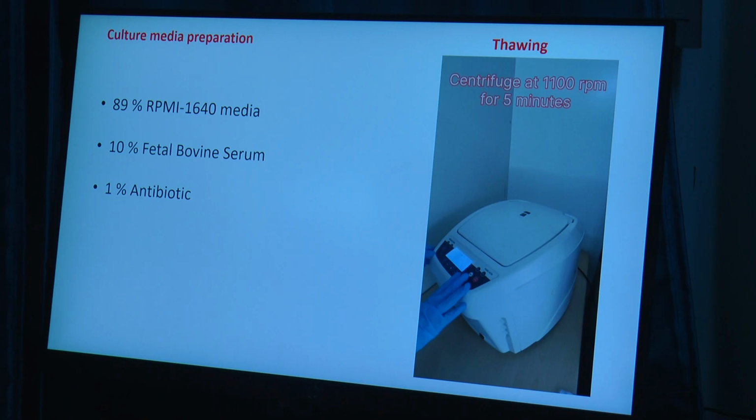See, this is a very basic thing, but usually people do it with a water bath also. We have this cell culture facility very new here, so if we don't have that, this is one alternative you can say. So, water bath, would you keep it at body temperature? Yeah, ma'am, 37. Because that's where they would... Yeah. So we don't have that alternative. Because you shouldn't heat higher, right? Yeah, then you will destroy them. We do everything with the cells at 37. So that's why you're doing it with your hand, because that will likely bring it down. Yeah, actually, yeah.